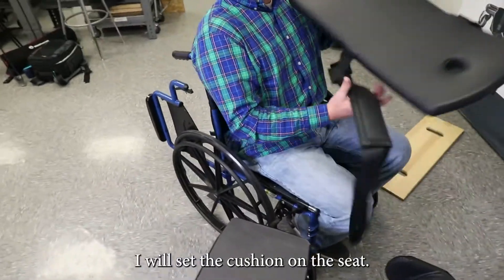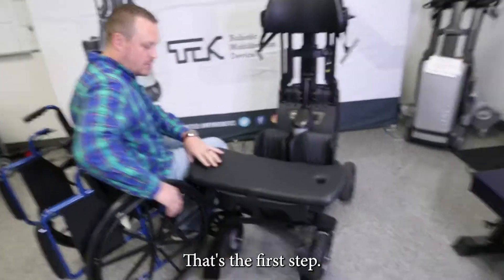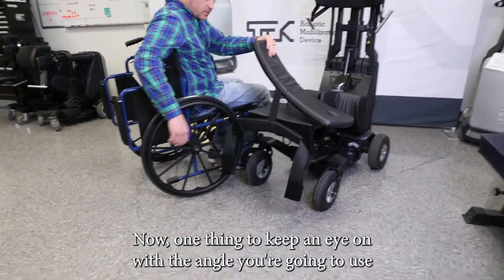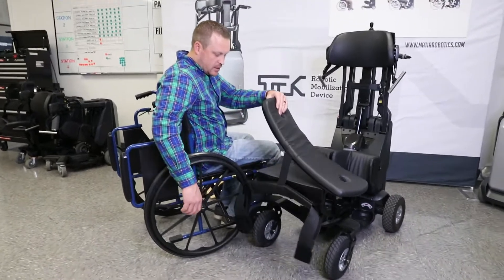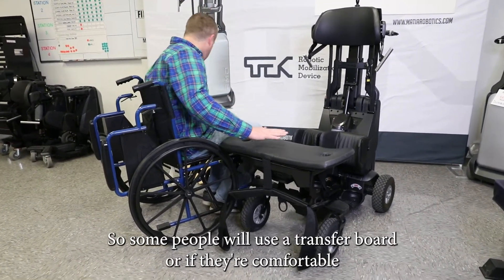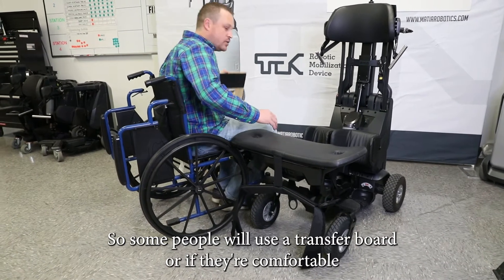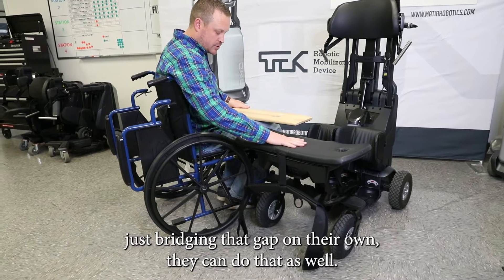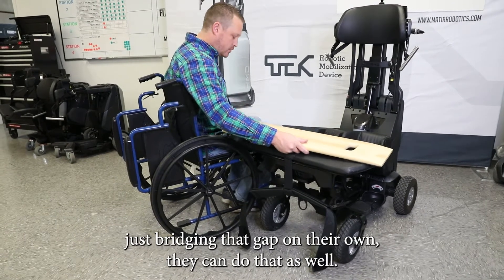I'll set the cushion on the seat — that's kind of the first step. One thing to keep an eye on: with the angle you're going to use to get into it, there is going to be a little bit of a gap here. Some people will use a transfer board, or if they're comfortable just bridging that gap on their own, they can do that as well.